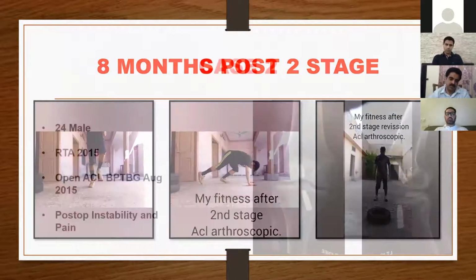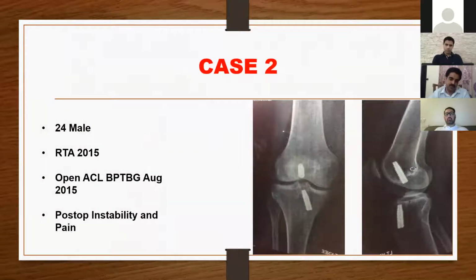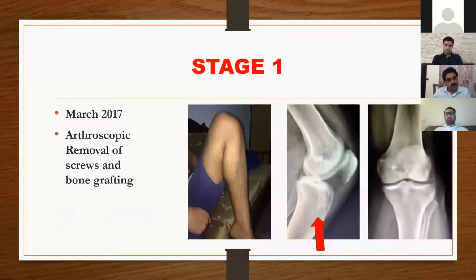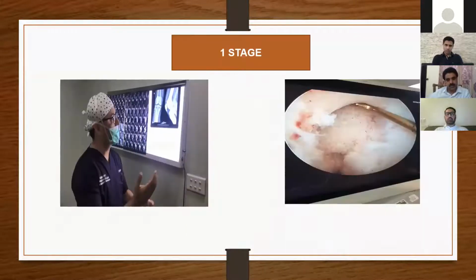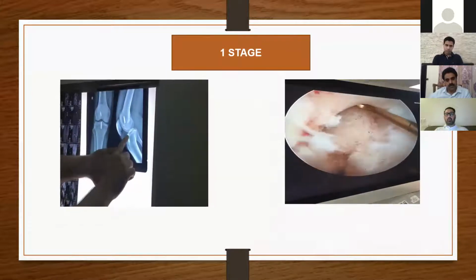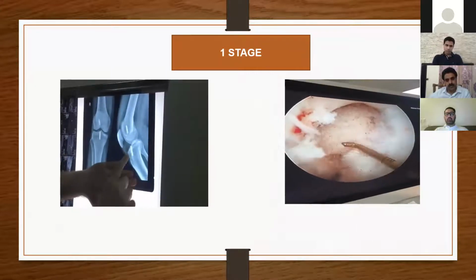Second case, 24-year-old male, exactly on the same time he came to me, open ACL with BTB, post-op instability and pain. 2017, we did the arthroscopic removal of screws and bone grafting. First stage revision, as I mentioned, exactly the same planning. Remove the screw, pack it with the graft. You have to pack it well. Do the meniscal repair if required.